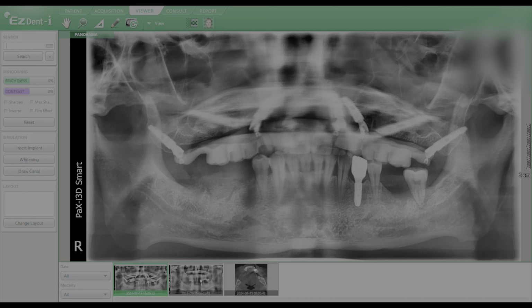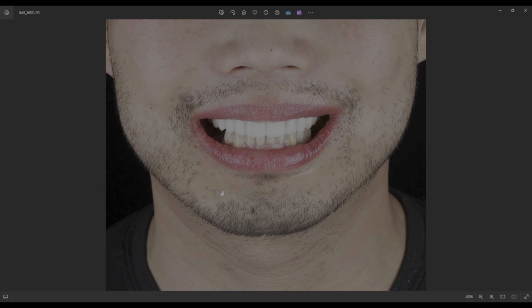And so that's the thought process on this. Let's look at his photos afterwards. All right, here we go. Dr. Koukousaki did a great job restoring this case. Yeah, everything looks great. And again, these are just his temps, so we'll change those in the future after we place those 2 other implants. And again, the biggest thing was we were able to hide his transition line, right?